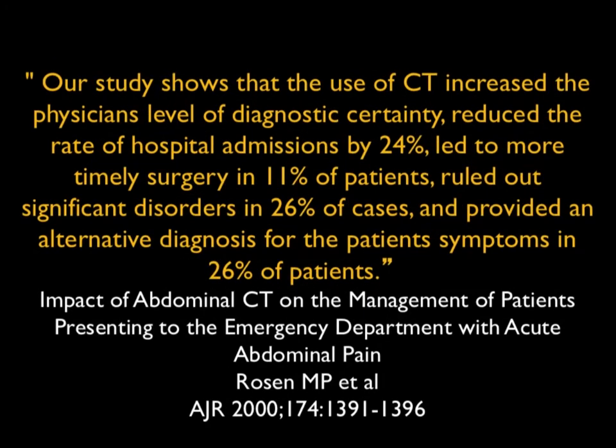You can see from this article by Rosen, this going back 17 or 18 years, use of CT increased physician confidence, reduced the rate of hospital admissions, led to more timely surgery, ruled out significant disorders, and provided alternative diagnosis. And you see this article, even though it's 18 years old, made the 3 biggest points.